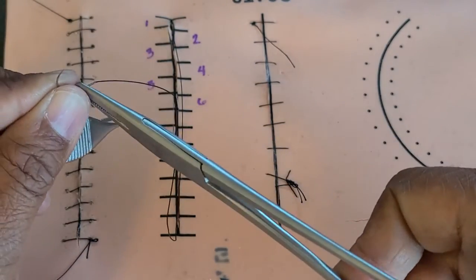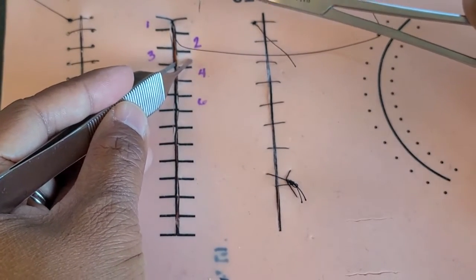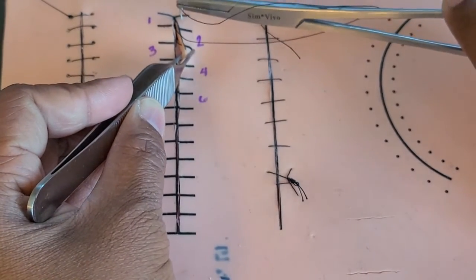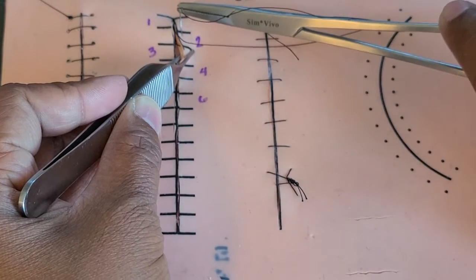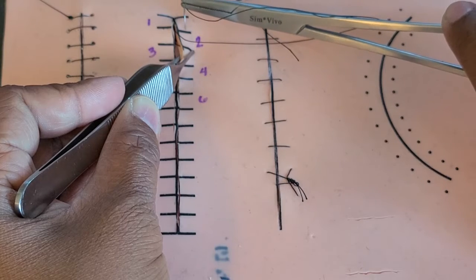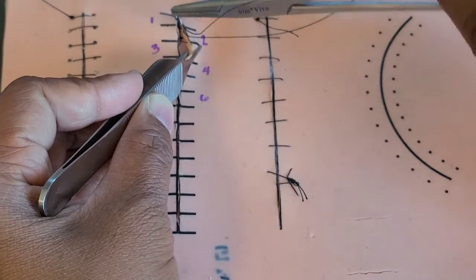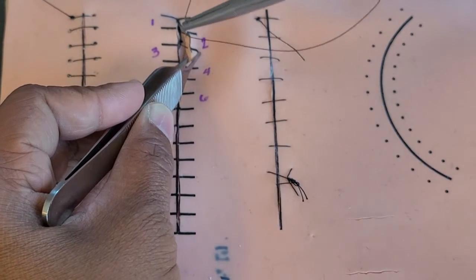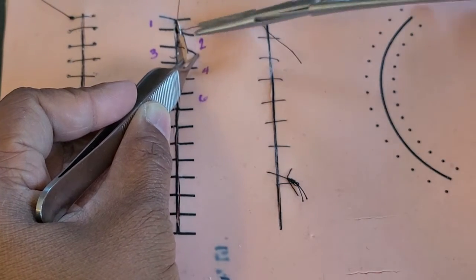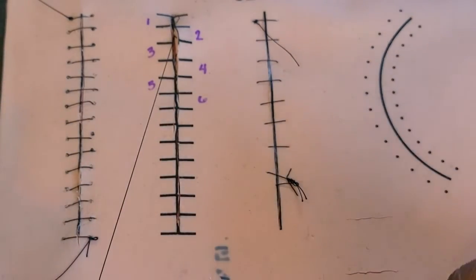I'm going to reload my needle, and because we're going on the other side, I know that it can feel a little funny or unusual to be driving your needle from the other side because you're just not used to it. I ended on this notch, so I'm going to start on the same notch, but on the other side of the incision, again going from one end to the other. Where your forceps is, is another way of guiding.